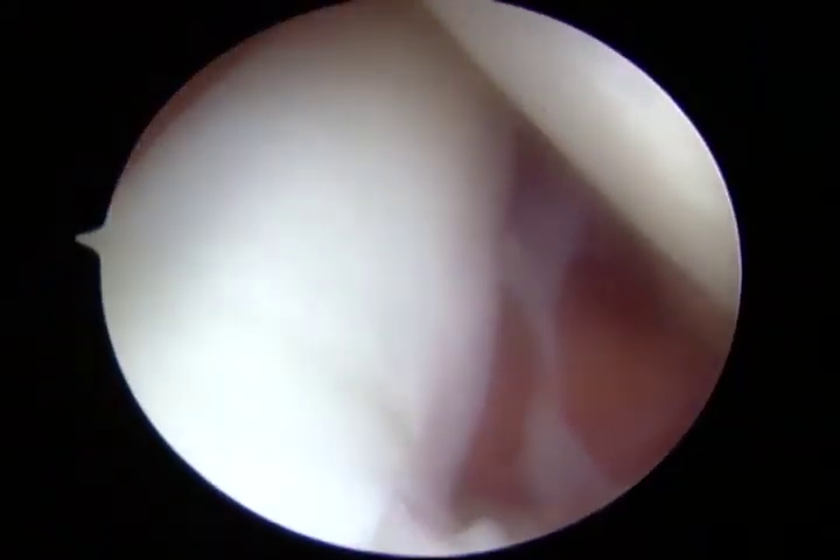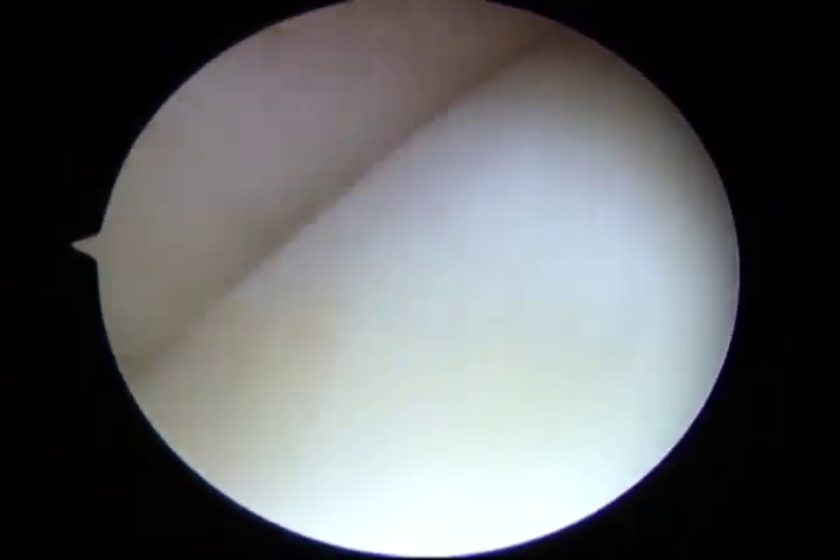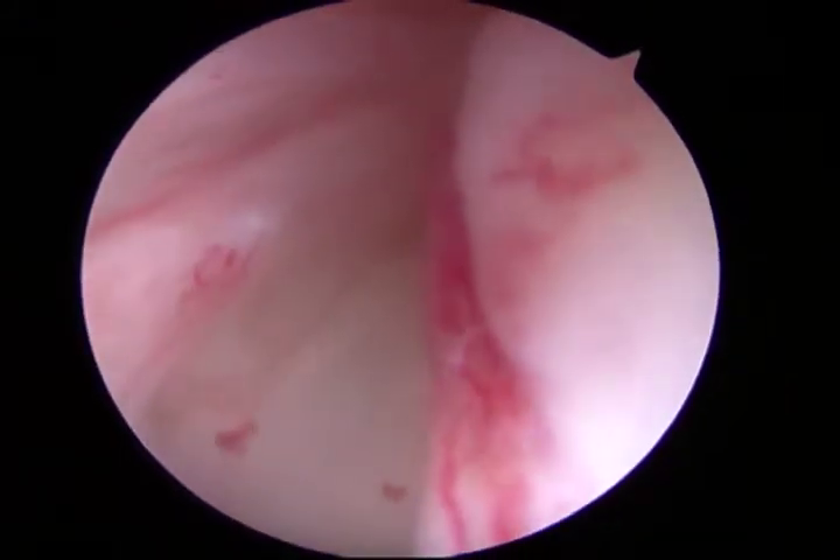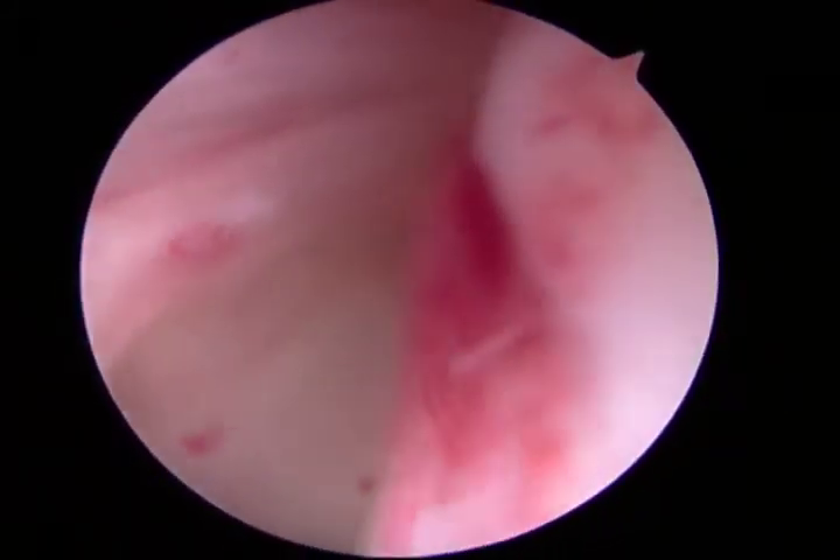First, diagnostic arthroscopy is performed using a posterior viewing portal to ensure that no other pathologies exist outside of the long head of the biceps. The exam starts with the assessment of the long head of the biceps. In this case, the arthroscope is directed anterior superiorly near the bicep sheath, revealing significant tenosynovitis.